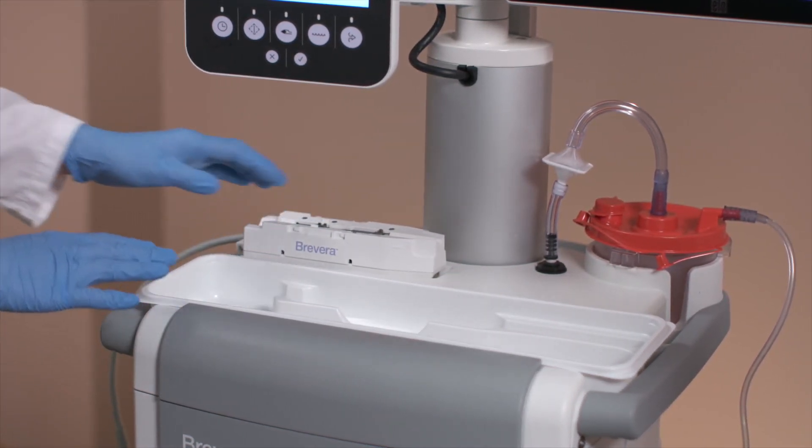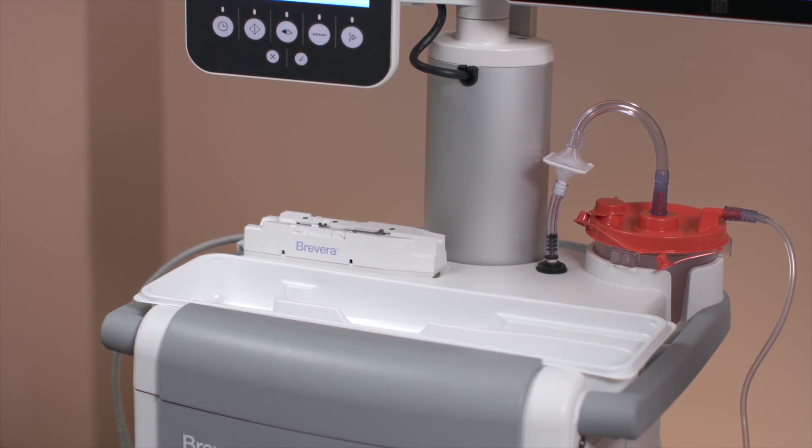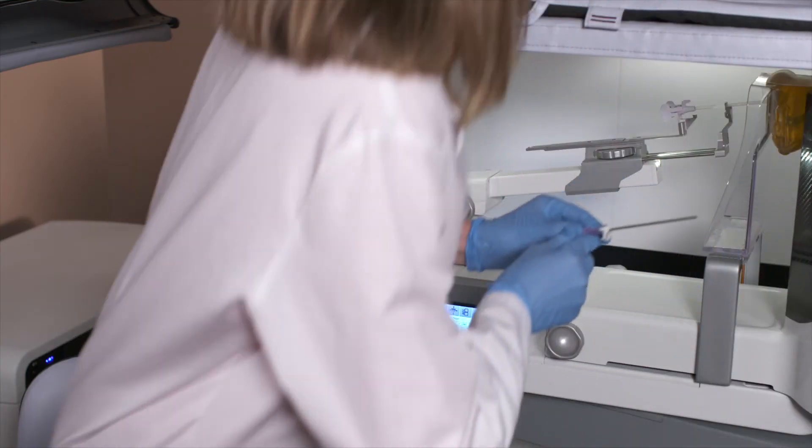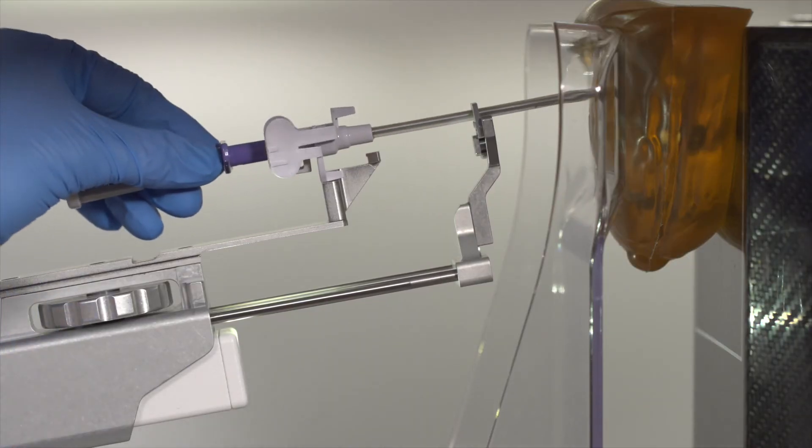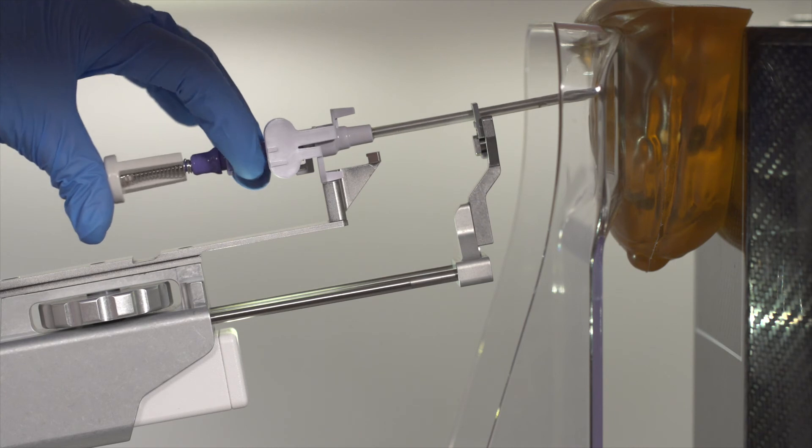Then, slide the driver onto the driver holder on the console. If desired, the physician will insert a biopsy site marker deployment device through the introducer. After the marker has clicked into place, the physician will deploy the marker.